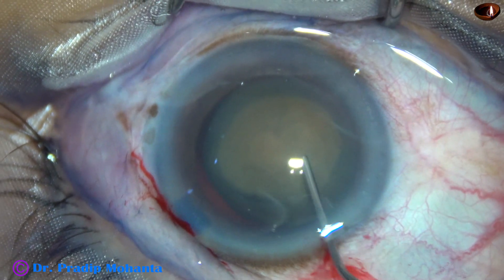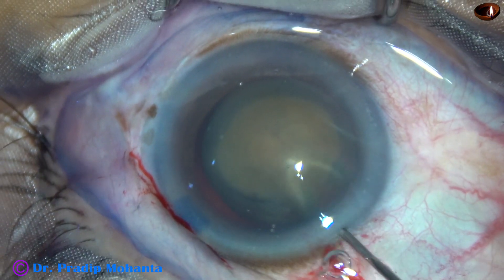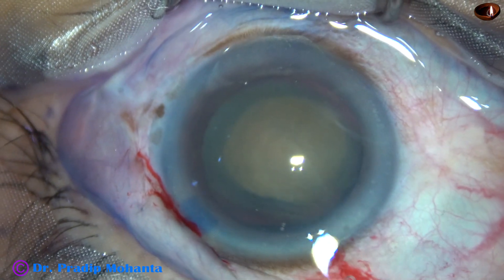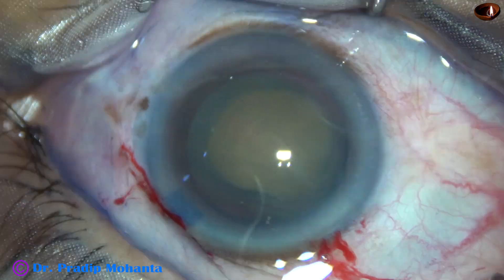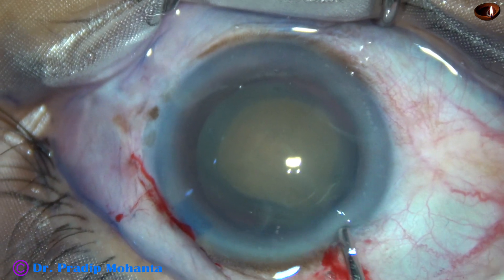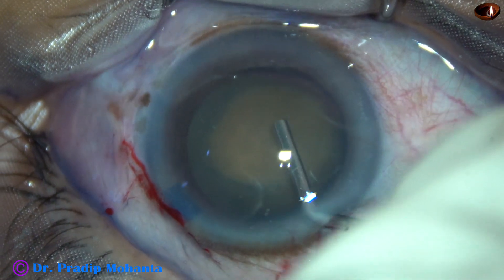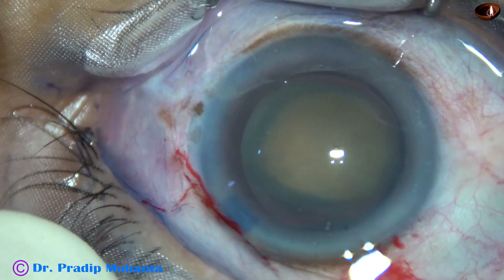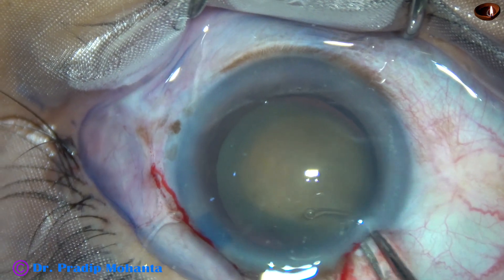And now I am doing a bit of hydrodissection, just to see if the nucleus becomes free from the capsule or not. Yes, it is free. Some viscoelastic — that is 2% HPMC — is injected.